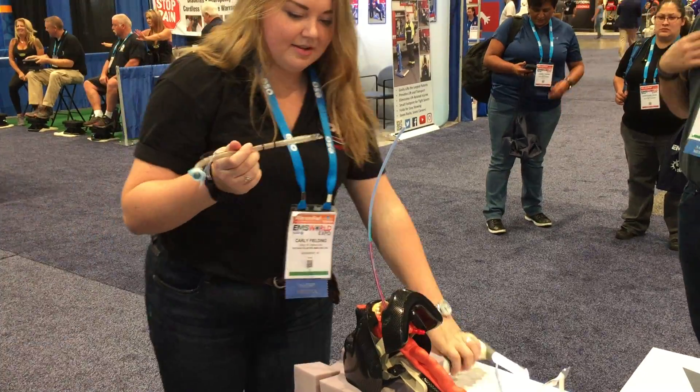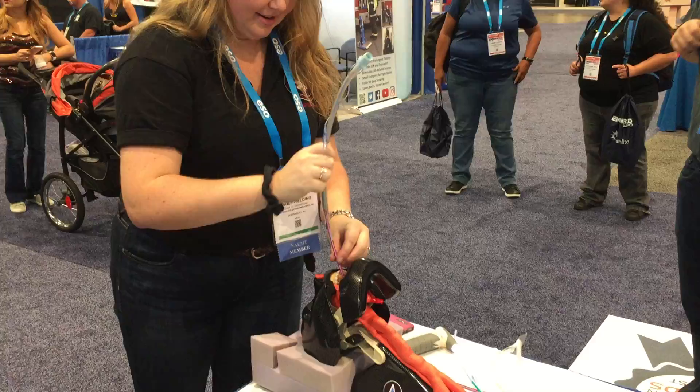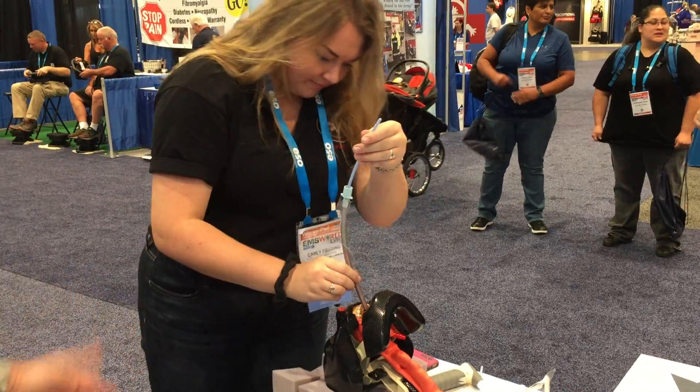Now pass that over the blue thing. What's the blue thing called? Bougie? The blue thing. The blue thing, exactly. Now you're going to follow your standard protocol — 22 to 24, or whatever your preference is.